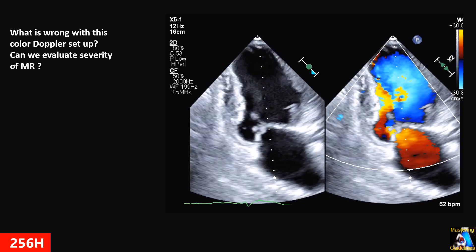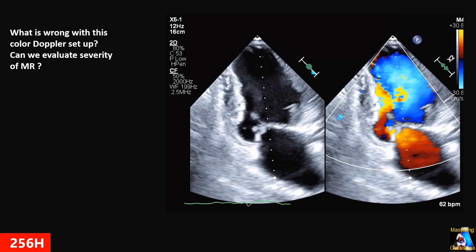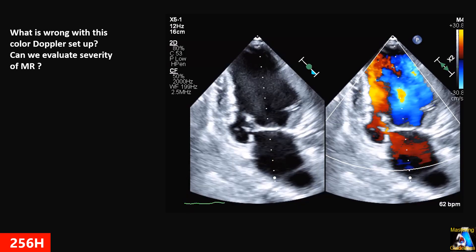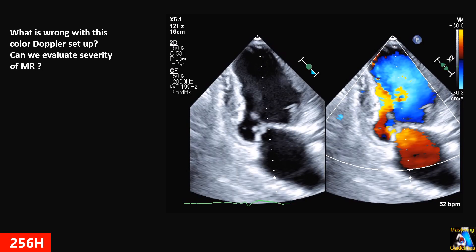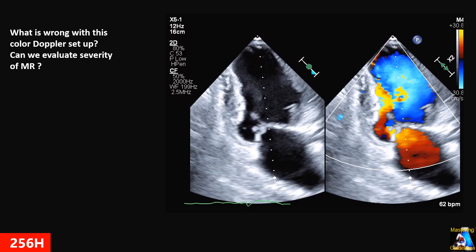Here we have a case — apical two-chamber. What is wrong with this color setup, and why did the tech do this? How can we fix it and make it correct, if you want to focus on the mitral valve? And can we use this setup for evaluation of grading based on the jet area on the mitral valve MR or not?